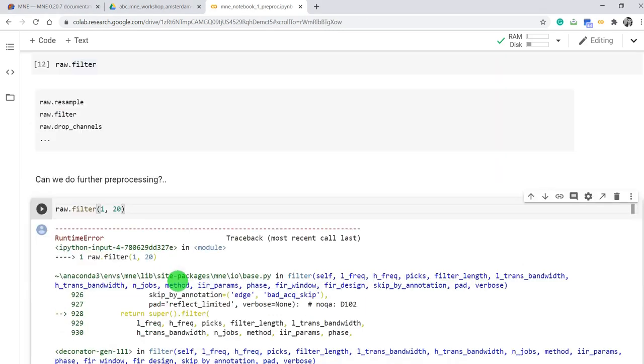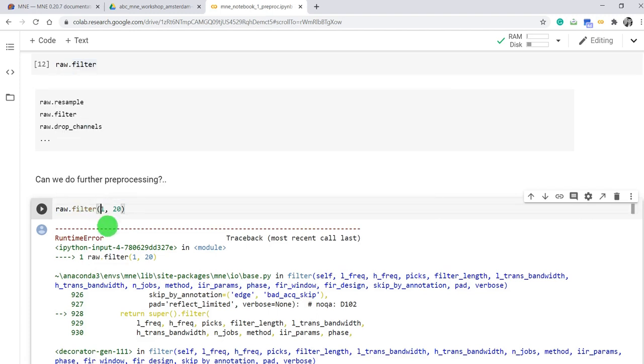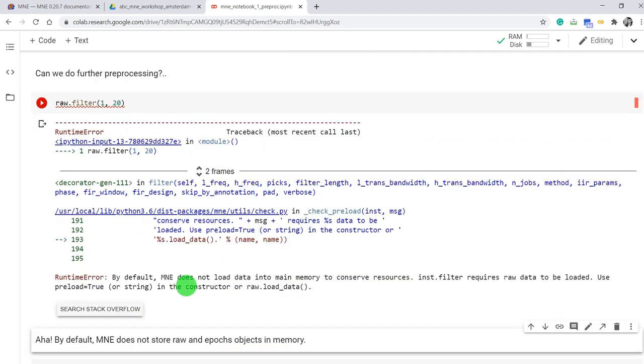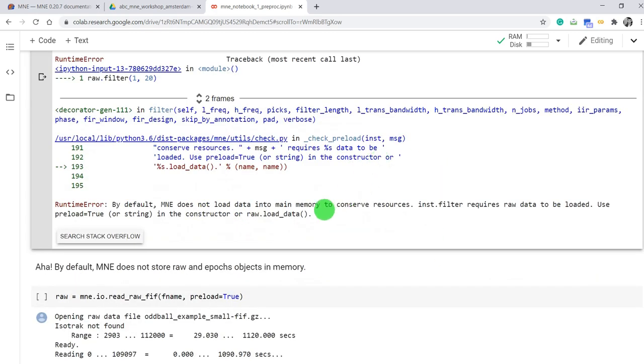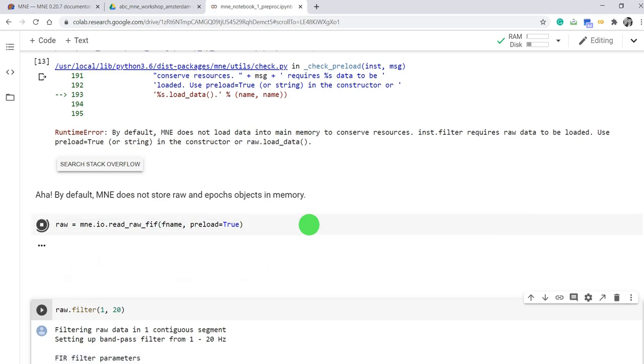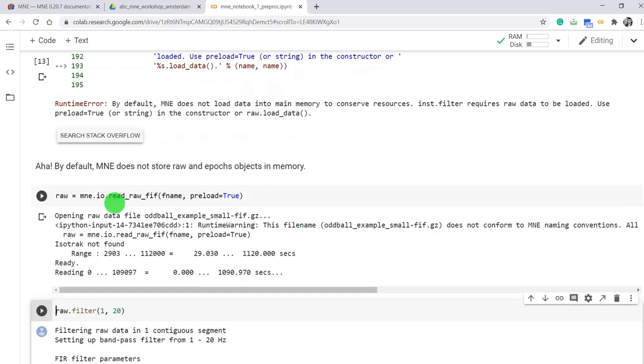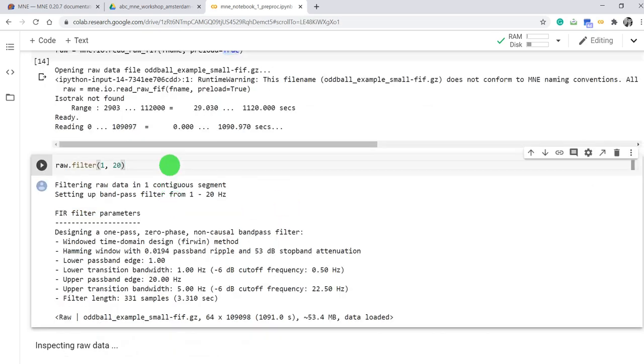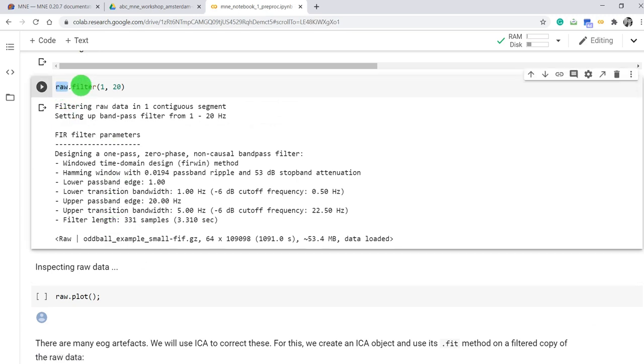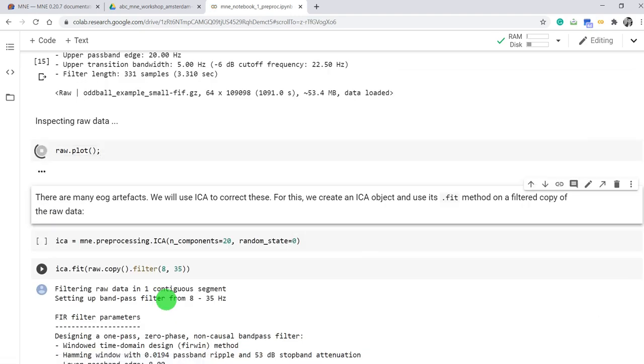Let's try to do a simple filtering. So we can define the bandpass filter as follows. So low frequency cut and then high frequency cut between let's say 1 to 20 hertz. So we run into a problem. Some error. Why? Because when we load the data, we need to... The MNE by default doesn't load it into memory. It just links to the file in the directory. So we need to define the option called preload true. Let's try again. Now we load the data again with the following set. So preload. Load the data. And if you do filtering after that, you can see it works. So we are filtering or bandpass filtering the continuous data set we just loaded.